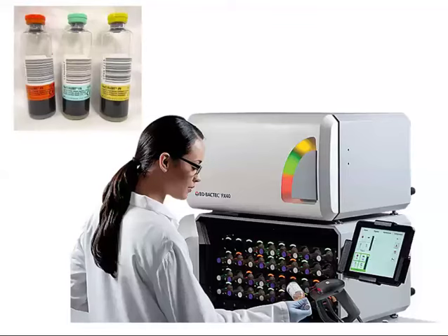Okay, so just to give you an idea, class, what we do with the blood culture bottle right after blood extraction. Since we are the ones who extracted the blood sample, we are also the ones who feed it to the machine. So, this is an example of the machine, the blood culture bottle reader. Okay, so we just barcode it, and automatically on the screen it will appear where we should place it.